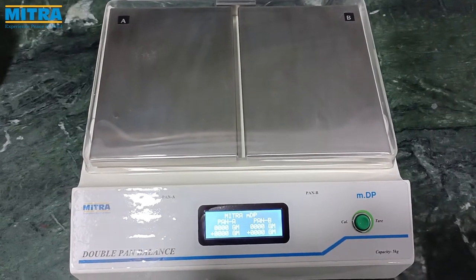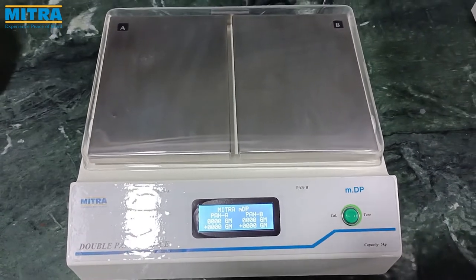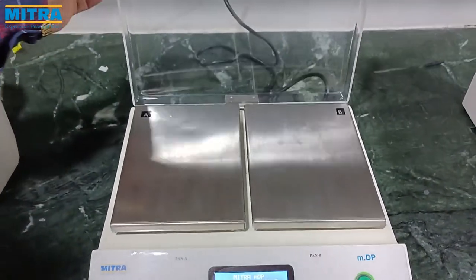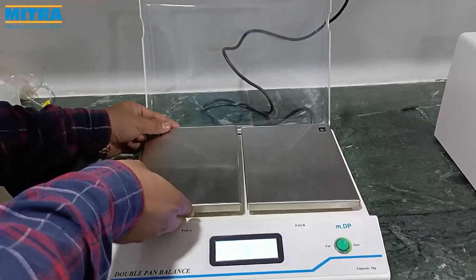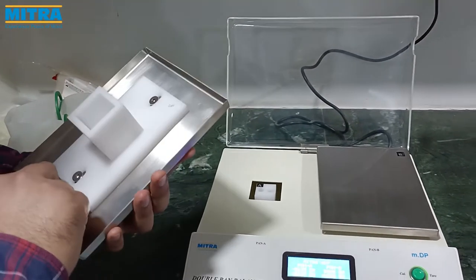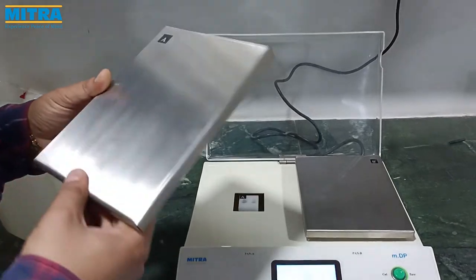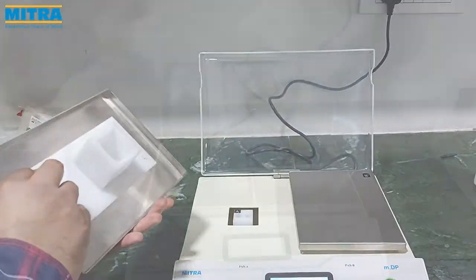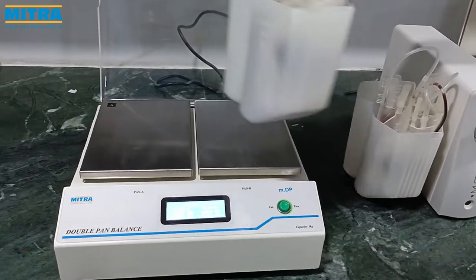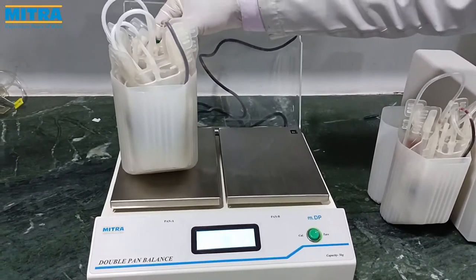The Mitra double pan balance has a safety cover made of fiber which protects both pans. Both pans are made of stainless steel and are removable. Both pans have magnetic adjustments which are used to balance blood bags packed in the centrifuge buckets before the centrifugation process.